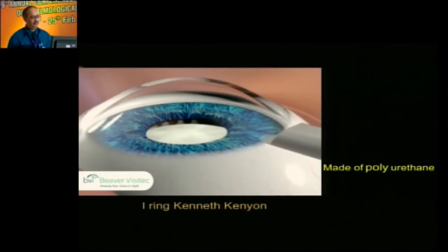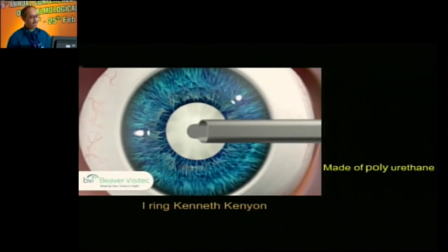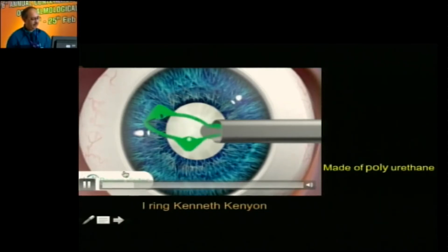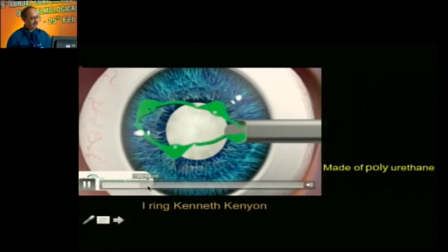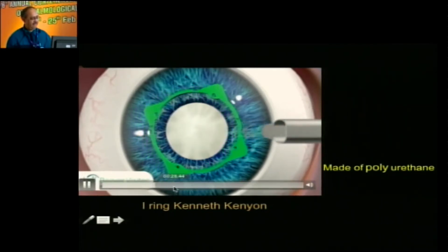Introduce the inserter through the primary incision, positioning the tip of the cannula centrally over the lens. This is another pupillary expander. Inject the ring above the iris by gradually moving the slider forward, while simultaneously withdrawing the cannula to allow the ring to be placed centrally. Completely retract the prongs prior to withdrawing from the primary incision.